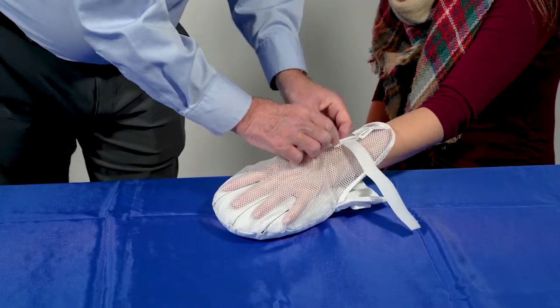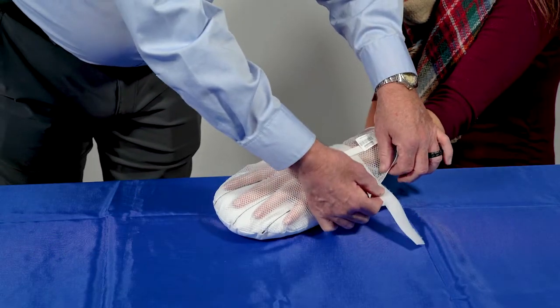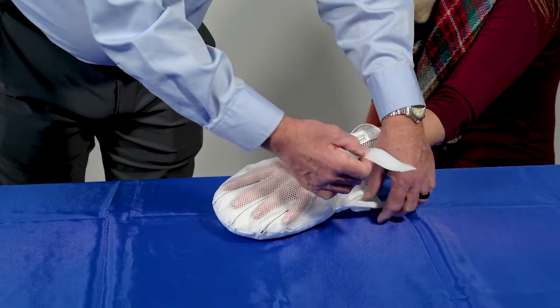Wrap the wrist strap around the smallest part of the patient's wrist, through the plastic ring, and then secure with the hook and loop fastener.